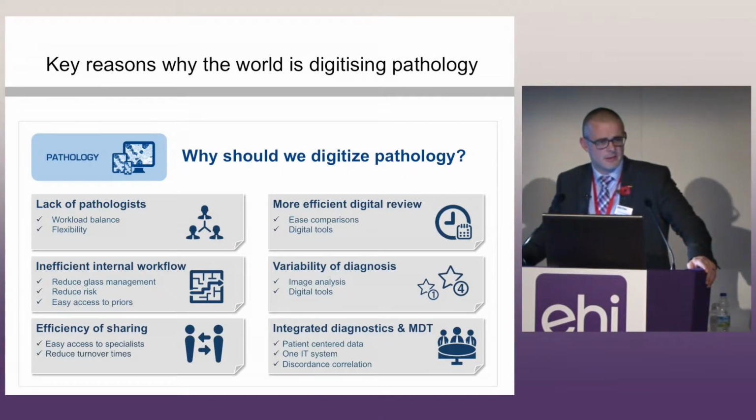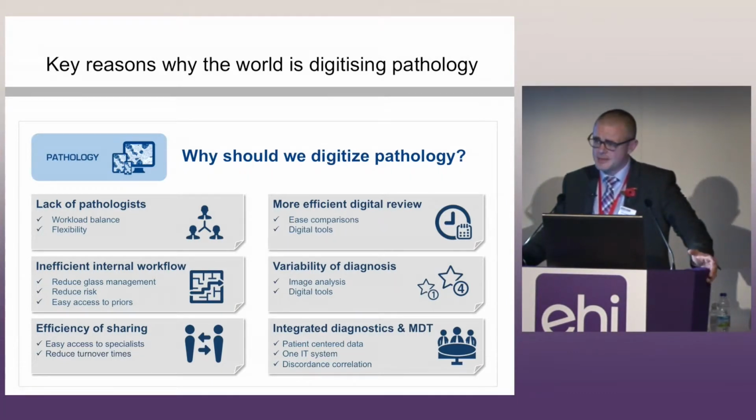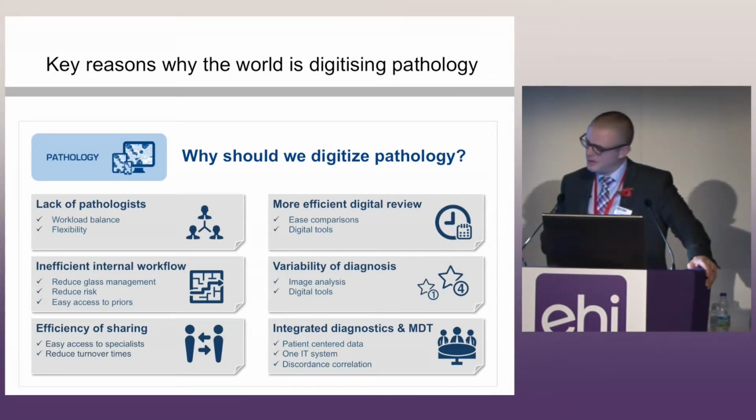Subspecialization is something that occurs naturally within pathology. There may be 2 or 3 lead pathologists on a specific pathology area. If you want an opinion from one of those pathologists today, then guess what? You've got to pack up those slides, put them in a jiffy bag, ship them at huge expense to that pathologist for that specialist review. Taking advantage of digital networks today, we can do that with the click of a button.